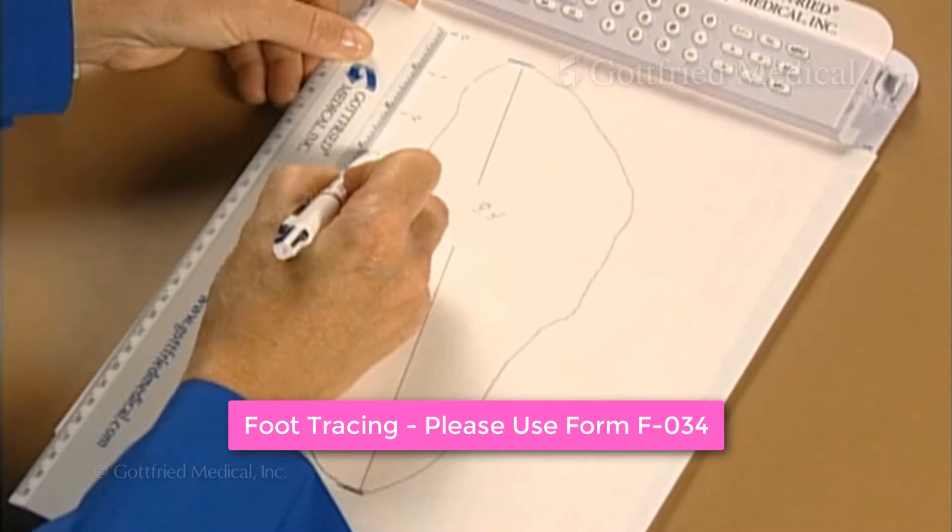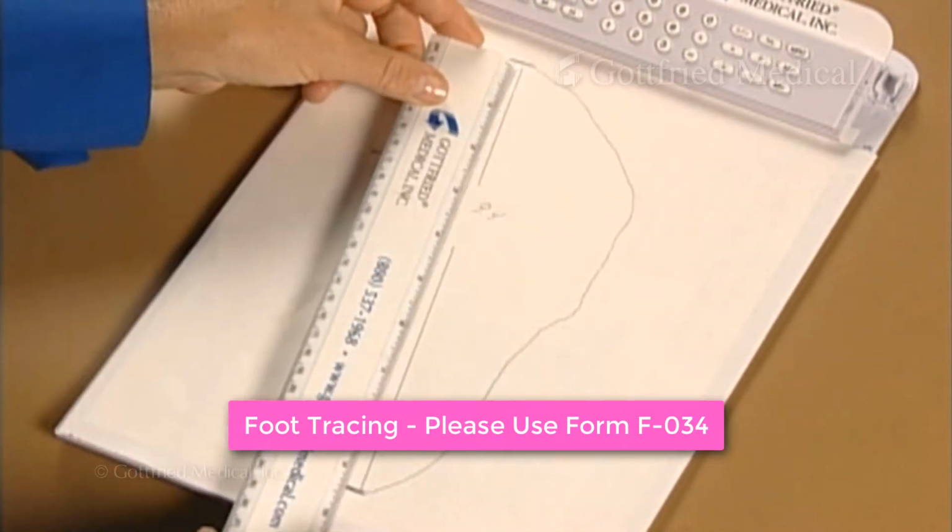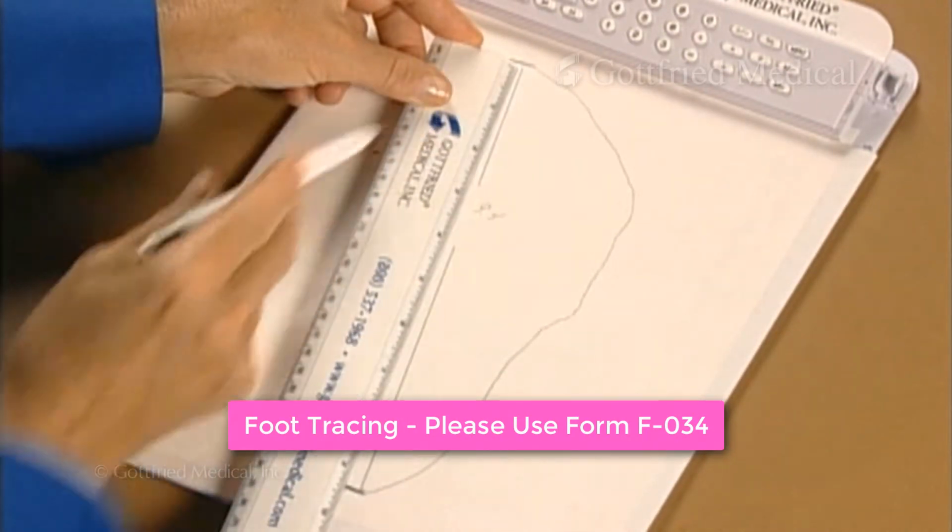The last step is to measure the length of the foot. This is required for all lower extremity supports and garments.